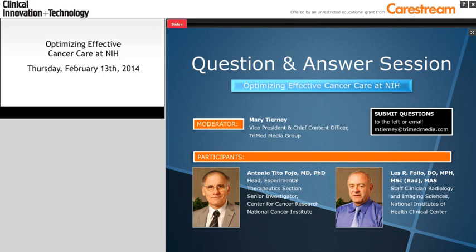I think now that you've added that clarification, yeah, this would be everything from a community setting where a cancer may be discovered at a local hospital, non-research, then referred to another center that might be an oncology setting or research setting, but to be compatible with measurements and images such as the DICOM standards that have occurred in the past, but more advanced to include measurements and tabulated data that now is more three-dimensional, especially since we're going to be routinely including volumes at several of the institutions, because many of the cancer centers are realizing that we need to go in that direction. So the standards have to be a little bit more complex than they used to be. So I would say everything from community to local oncology and research to more detailed research centers. So across the spectrum, essentially.